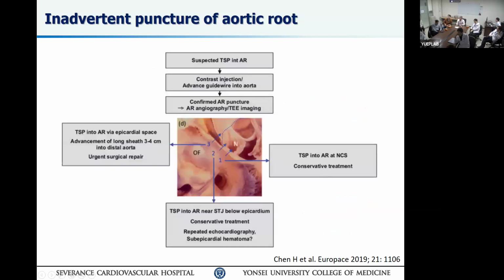In other words, you're not removing your sheath. Yes, that's the key. Now I want you guys to know they all went into the operating room with the sheath in. Second thing is that it helped the surgeon to control the bleeding much quicker. The surgeon will do the hemostatic suture around the sheath, pull the sheath back, and just close it up there. A couple of stitches, you're done.